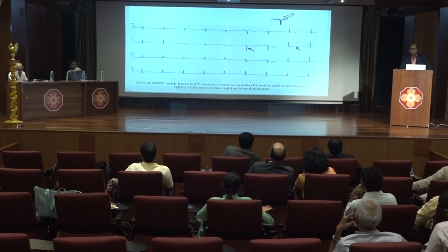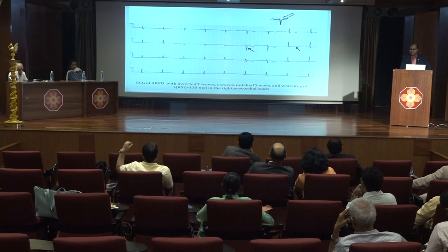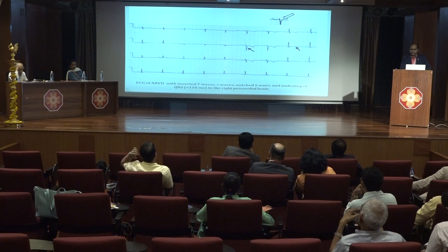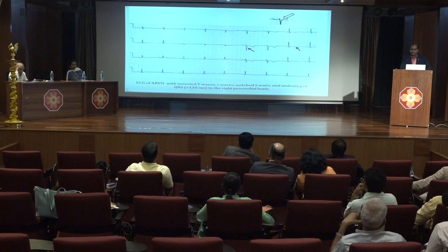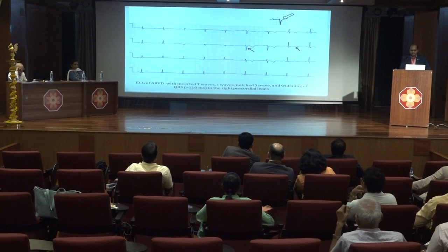This is a typical ECG of an ARVD patient, showing T wave inversion in leads V1 to V3, the epsilon wave, and QRS duration prolonged in the right precordial leads.